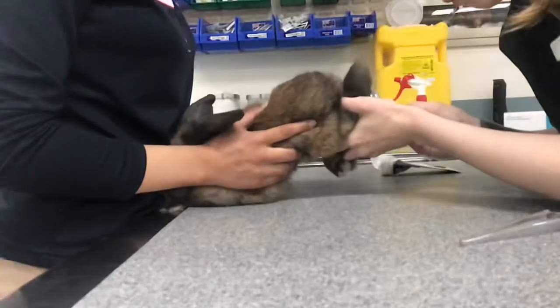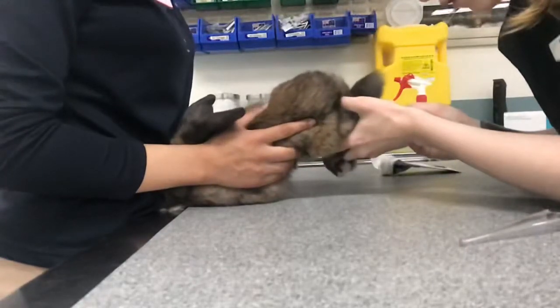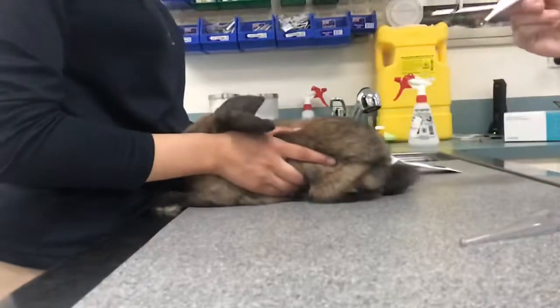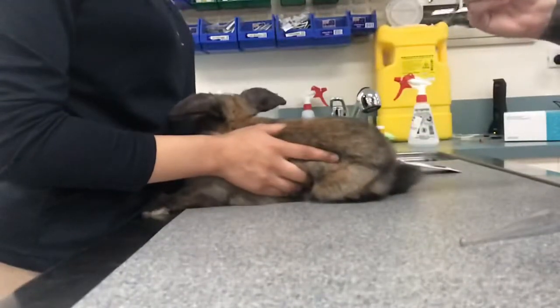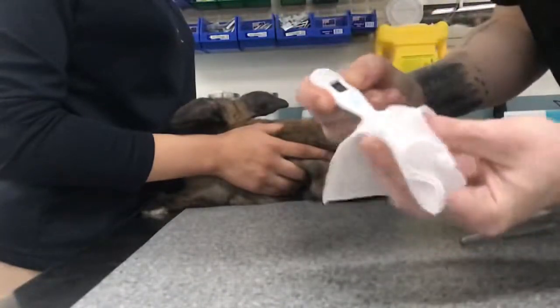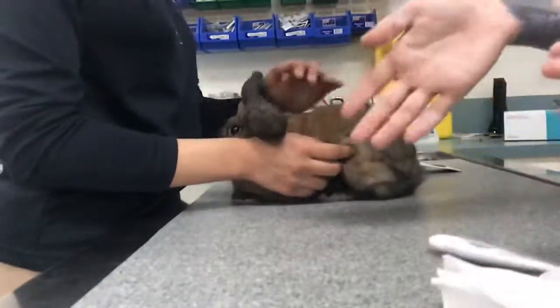Good girl. Amazing. I know. It's almost over now. Wait for the beeps. Take it out and disinfect immediately and take the reading immediately. It's 39.3, which is a little high for her, but probably purely due to stress. And then perform hand hygiene.